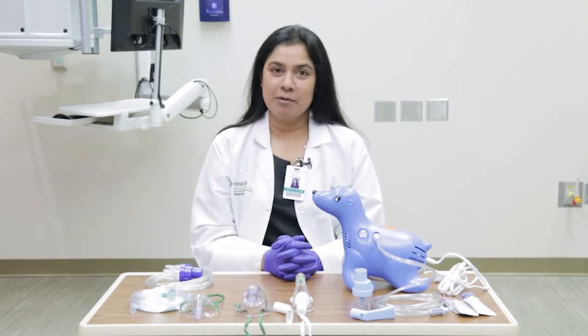Hey, I'm Dr. Kothri. I'm one of the pediatricians here with Parkview Health in Fort Wayne, Indiana, and I'm here to talk about nebulizations today. We'll go through some of the steps as to how to set up the machine and how to make sure your child is getting the treatment that they need.